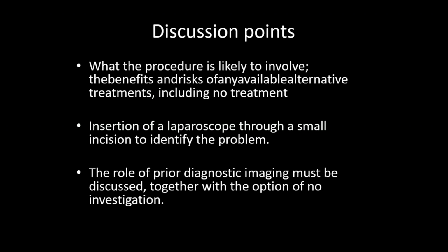But in EMQs, the laparoscopy guideline will come as an EMQ of post-operative complication or intraoperative accidental injury. So let me give you a few small points about how you can generally manage accidental injury during laparoscopy.